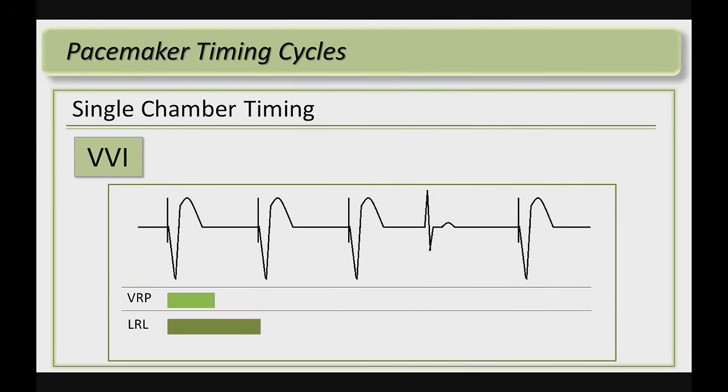If we look closer at that first beat, the pacing pulse would be labeled as a ventricular pace. Shortly after, the T wave could potentially be labeled as a ventricular sense, but because it lands in the ventricular refractory period, this T wave will be ignored.